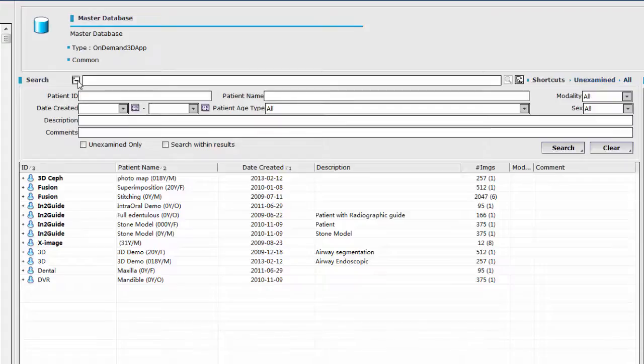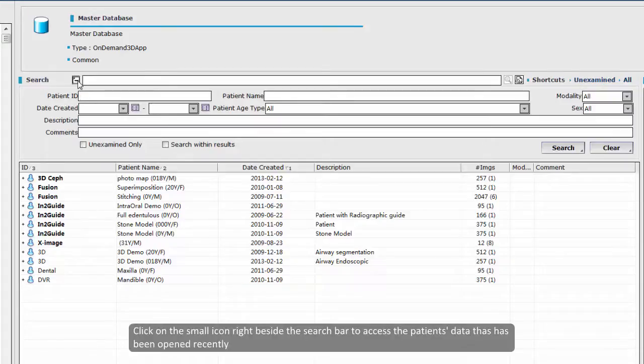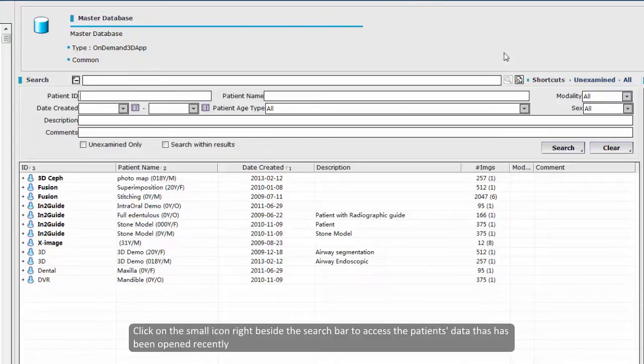Secondly, you can click on the small icon right beside the search bar to access the patient's data that has been opened recently.